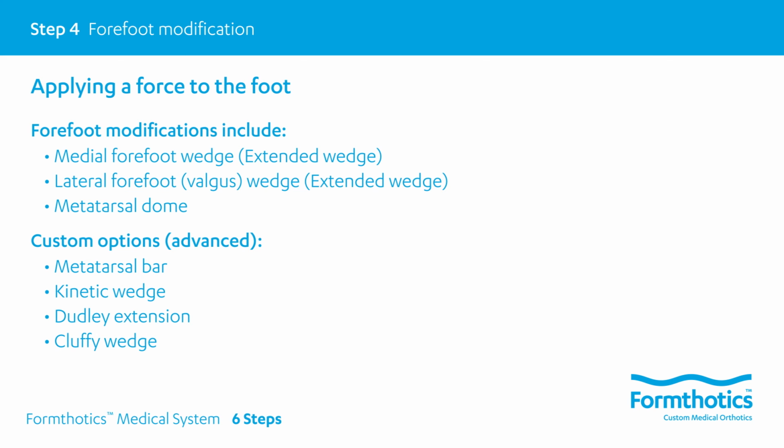Know when to seek further advice. Orthotic modifications are complex. It would be good to refer to a biomechanically experienced podiatrist, particularly when considering use of one of the more advanced options.